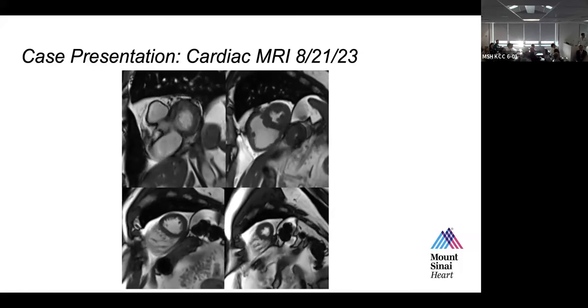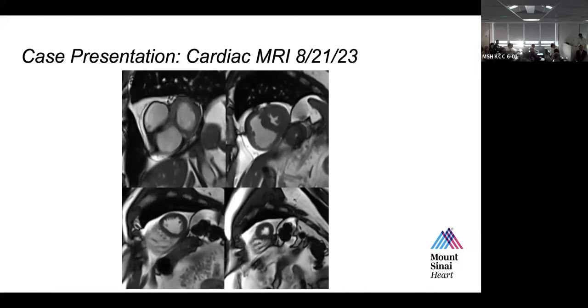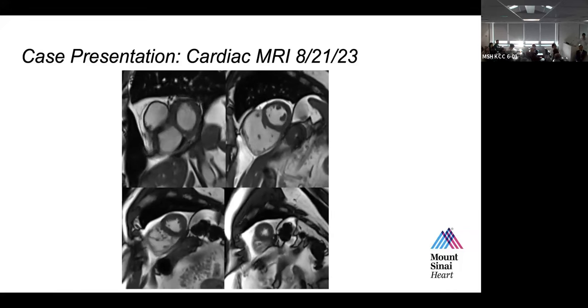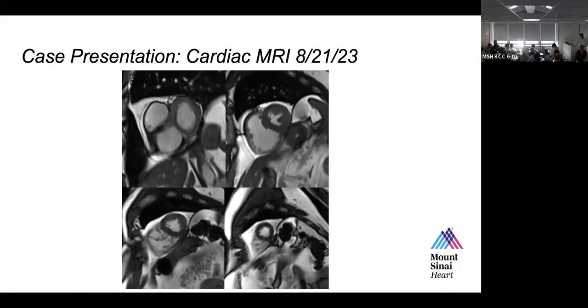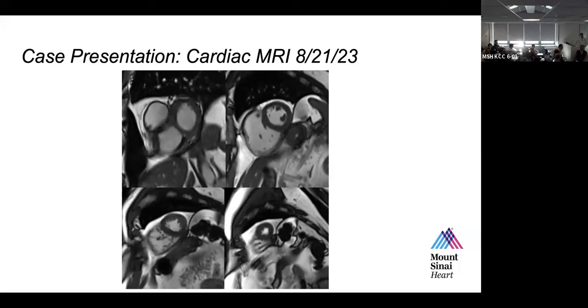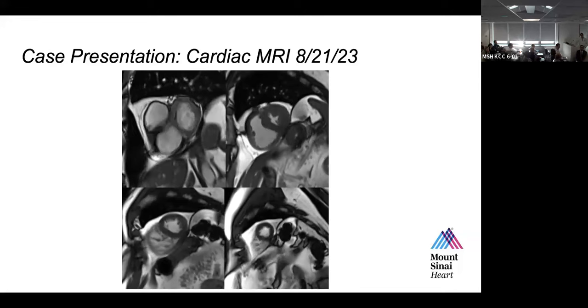Other than that, everything we've seen, we also see part of the atrial septum on that first top view on the left, which is at the base. Part of the atrial septum, you see it, but not really. As was mentioned, if I get a patient with RV volume dilation, and the question is, why is the RV dilated? I would prescribe a cine sequence that is what we would call a bicaval or a sagittal of the atrial septum. That would be 5 to 6 millimeters, and that would span from the right upper pulmonary veins, so from the right-sided pulmonary veins, all the way to the aortic root. And that would allow me to exclude most interatrial shunts, except for probably an AV canal or a primum atrial septal defect, which is best seen from a 4-chamber. Great.